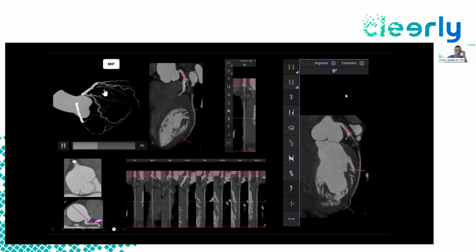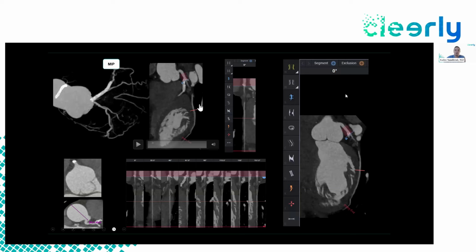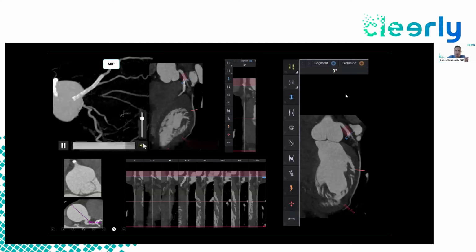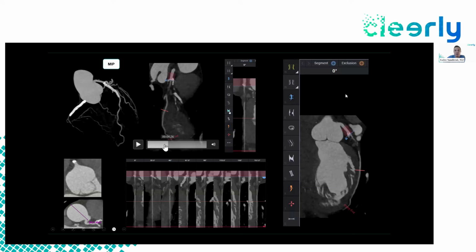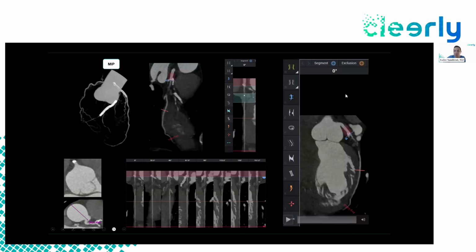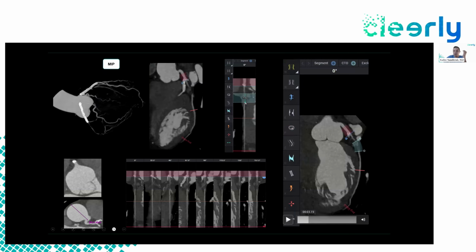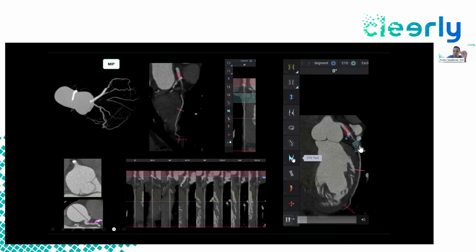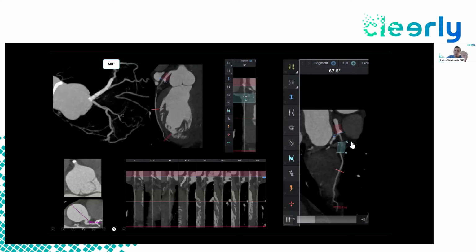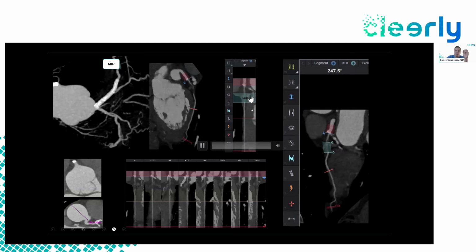And as you can see, this is just from a traditional CT software, a MIP projection. But now with software like this one here from the Cleerly platform on the right, you can see how you can easily get nice segmentation of where that CTO is. But particularly, I really want to highlight this tool here on the right, which is automated CTO detection. You just go to the multiplanar reconstruction that told you there was a lesion, click there on the CTO tool, and it will automatically detect where that CTO is. And if you know where that CTO is, then you can bring the distance tool and measure that CTO length.